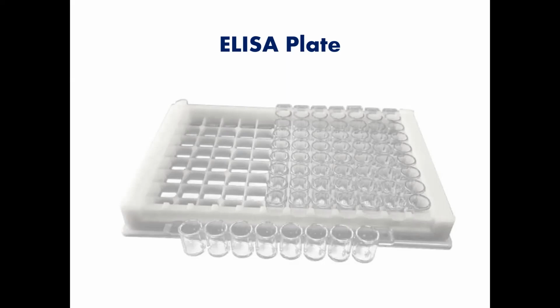During electives, I observed that they preferred to use serum instead of whole blood. What would be the effect? As I said, whole blood contains a lot of background. So you either use plasma or serum, and serum is better. You get a lot of noise from RBCs and other cells. A lot of non-specific binding is basically what I'm calling noise, which means when you look at the background, color will be so much. So you use serum because it has less things that will cause non-specific binding.